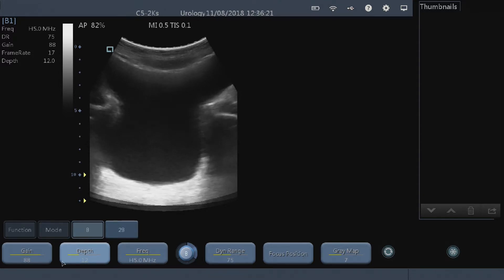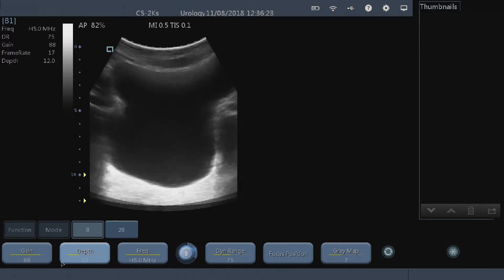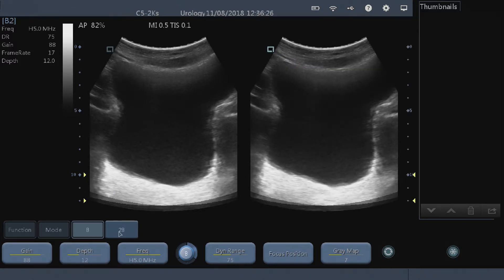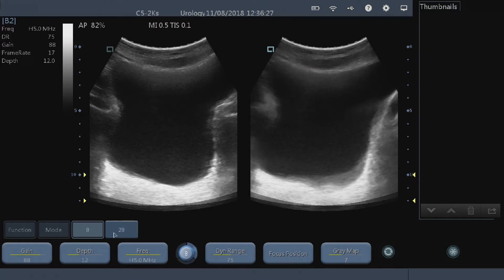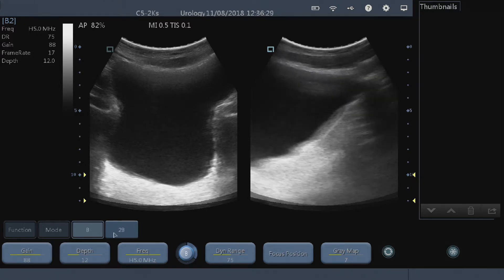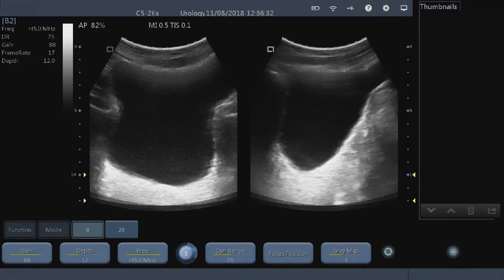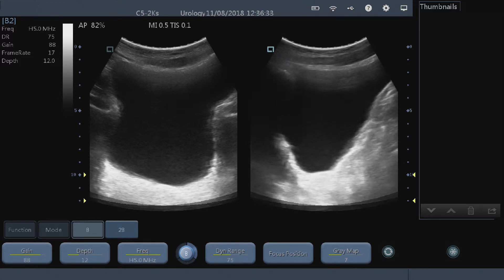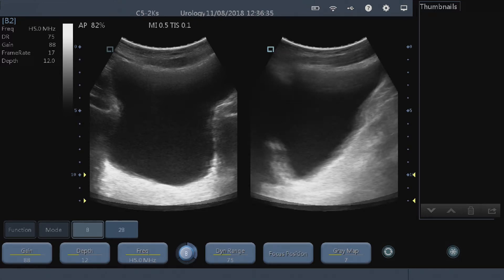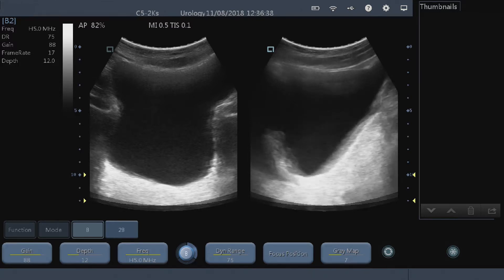We hit 2B again and then we're going to go and get a sagittal view of the bladder on the right hand side of the screen, so just get that image up there as well.